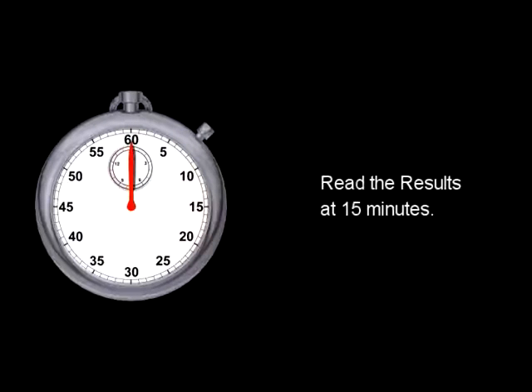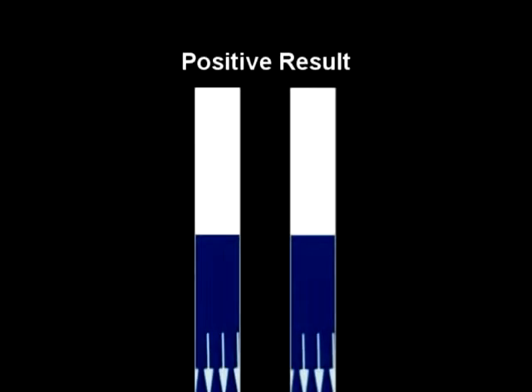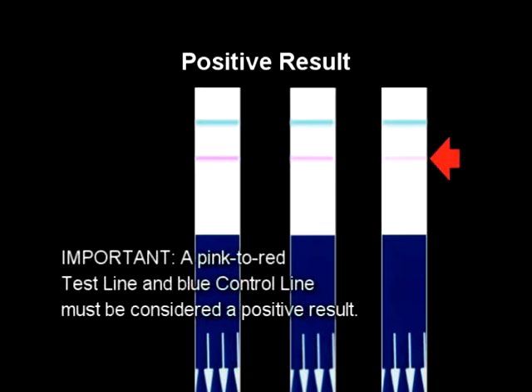Read the results at 15 minutes. Some positive results may appear sooner. The presence of a pink to red test line along with a blue control line means that the test is positive for respiratory syncytial virus. Be sure to look at the test line carefully — if you see a very faint pink test line and a blue control line, you must report the result as a positive.